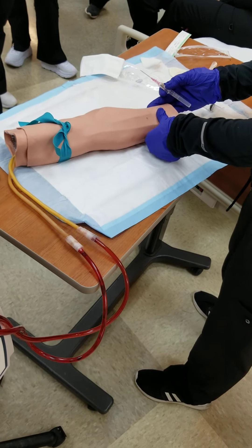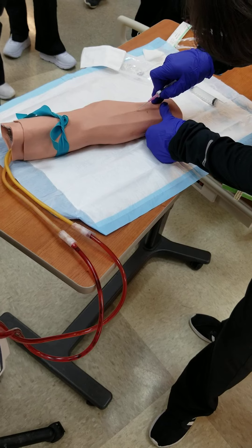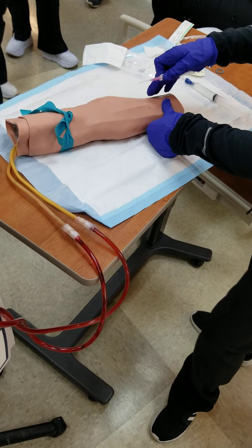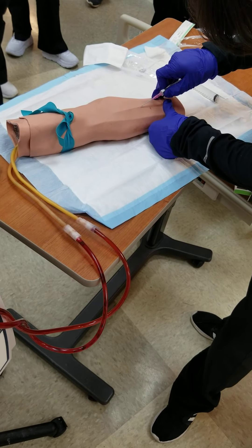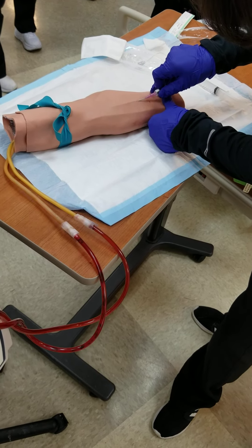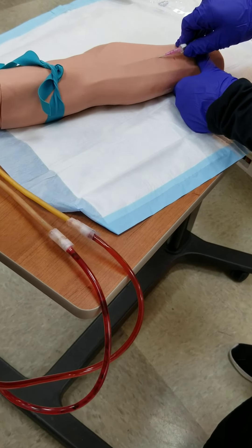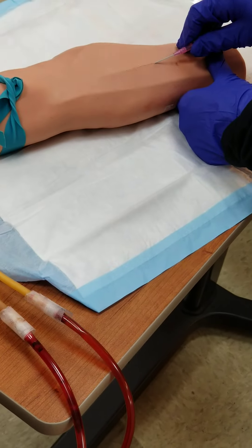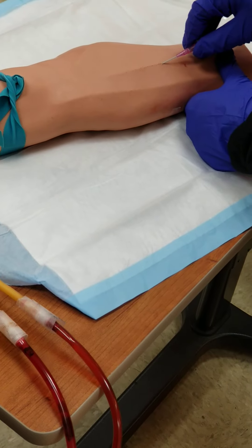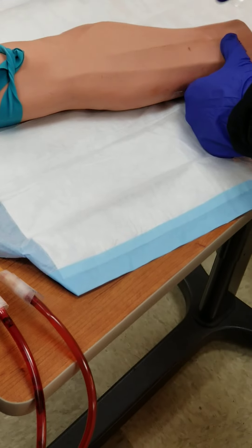We're going to pull the vein taut, just like that person said on the video. 10 to 30 degrees. You can stabilize here if you need to. Make sure your thumb doesn't get in the way of your angle. Bevel up. And you're going to go in until you see that flash. I don't think I got it because I didn't see the flash. Now, is it good to fish? It was close.